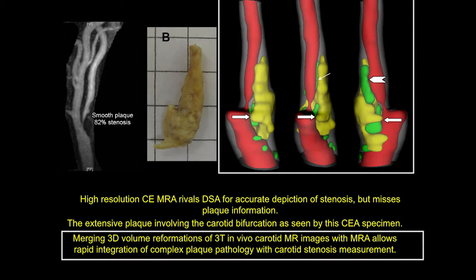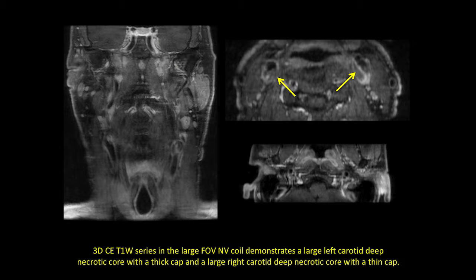So one of the first things we developed was simple volume rendering of the 2D imaging that we were getting of the plaque. Here we decided, sure, the lipid-rich necrotic core should look like chicken fat yellow. And so although admittedly these look a bit cartoonish, they're actually based on very rigorous science, and I find it's the best way in research mode to get across complex plaque anatomy to a clinician, and you're going to see I will use these a lot through the rest of the presentation.